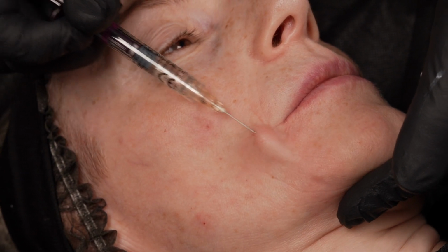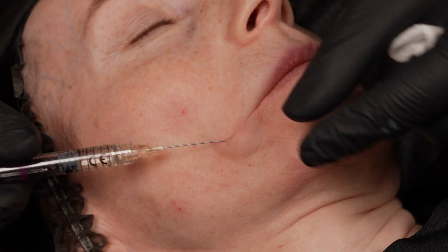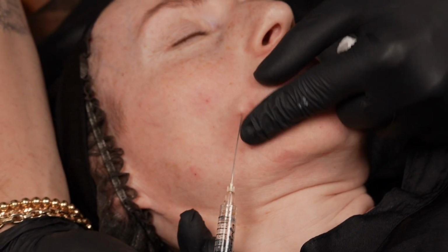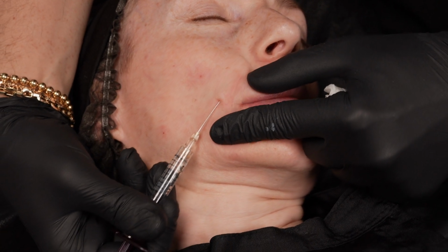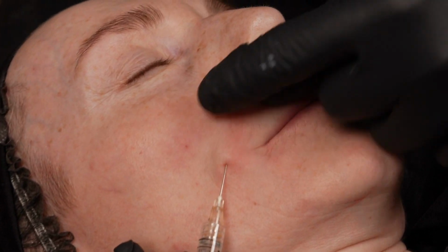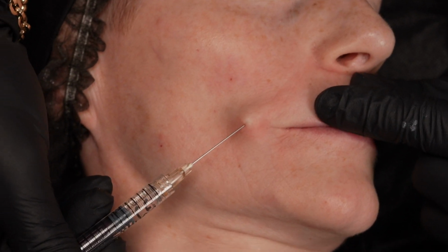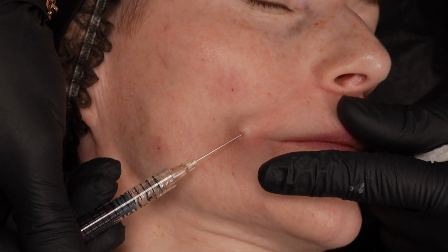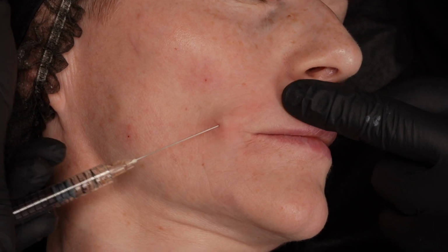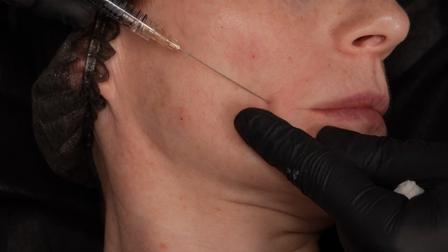Look, with the cannula we lift the mandibular zone, the mandibular ligament. Usually a needle is often recommended. We are watching a video from the speaker. Okay, done. This is a bolus. You can change your direction. I also do this area with a cannula. Come really superficial. You see how superficial I am? You can inject this fold. I love how you do the wall with your hand from the other side. Yes, from the opposite side you need to get used to it. Okay. So we can give a little bit more volume like here.